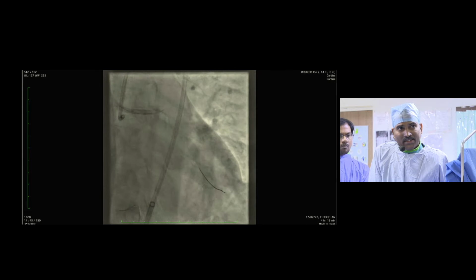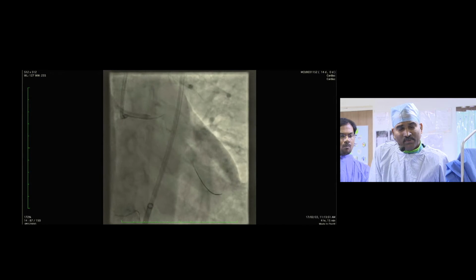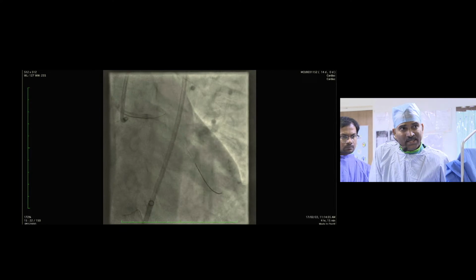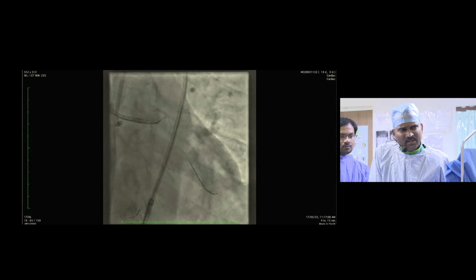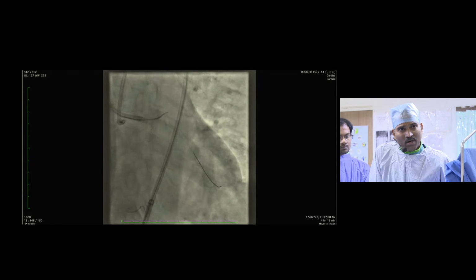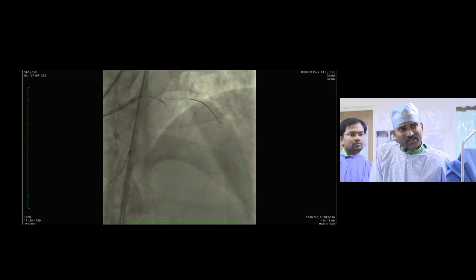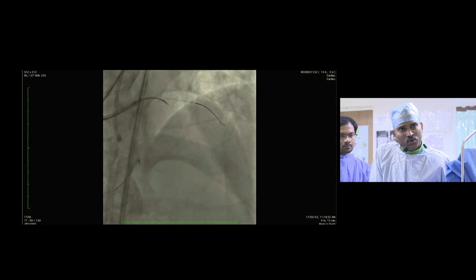So next what we did is basically trap and remove the Crusade catheter, and then advance Corsair over the antegrade wire. The key is, this is a trapper balloon. So you can see here, this is the Corsair. I am advancing Corsair into LAD. Whatever position you have got before, you have to secure with your microcatheter. Otherwise, you will end up doing the same steps again and again, and you will lose the battle. So we secured with Corsair into LAD. Now my Corsair is in the LAD through my preferred course.